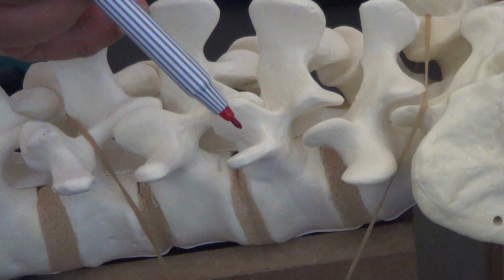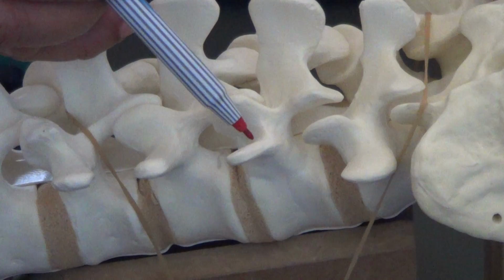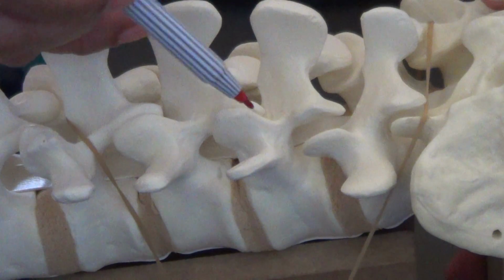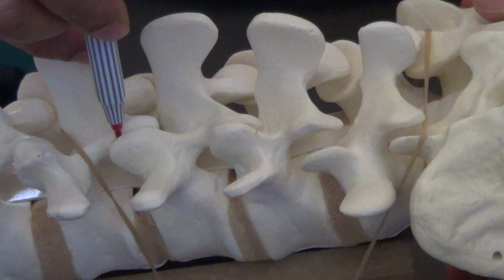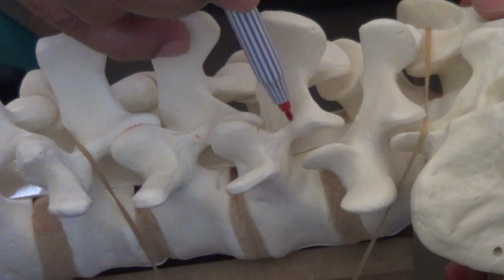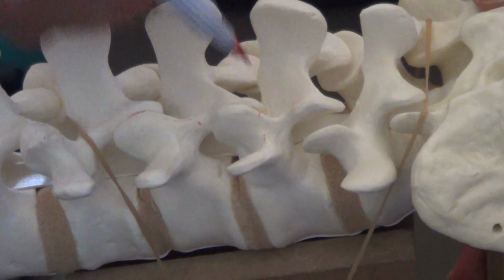In the lumbar spine, the entry point is, if you draw the midline of the transverse process, this is the classical entry point. Bring it up, and then you draw the line joining the two facets there, and where they meet, you enter, and then you go in.